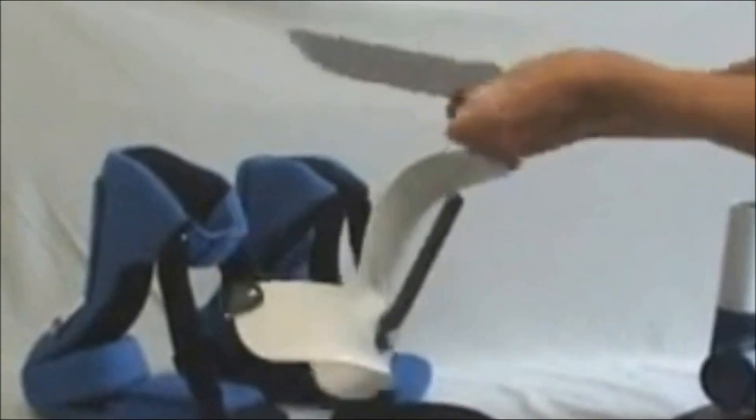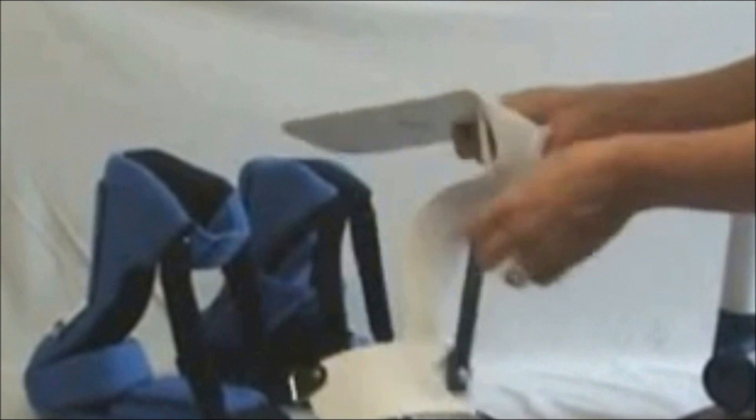Peel back the peel and stick hook so you have a smooth surface. Prepare it to be remolded. Just stick it anywhere out of the way. Then put on your gloves to protect your hands.